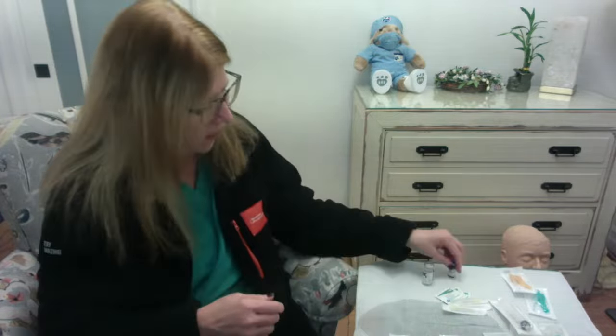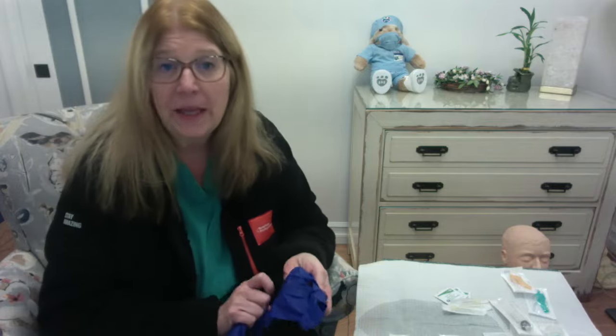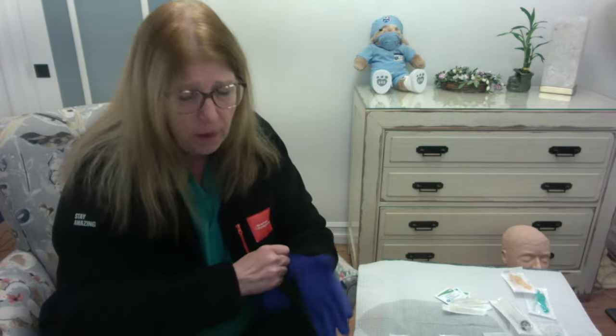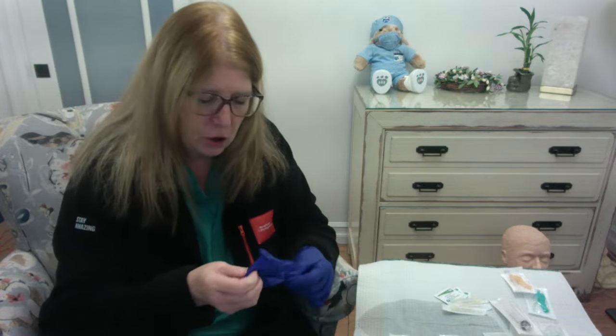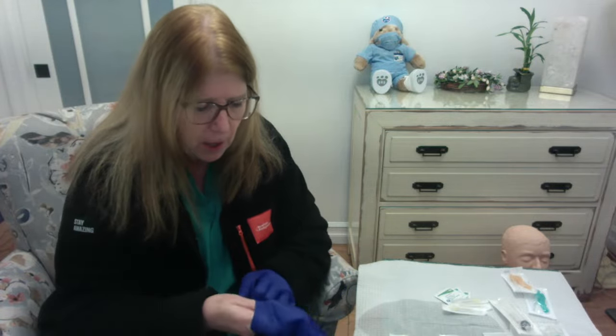The next thing that I want to show you is that of reconstitution. So you're going to get to practice this in lab as well, but reconstitution is about turning a powdered medicine into a liquid medicine. And when I say liquid, I mean parenteral medication, right? I'm not talking about a liquid that somebody could drink, okay?